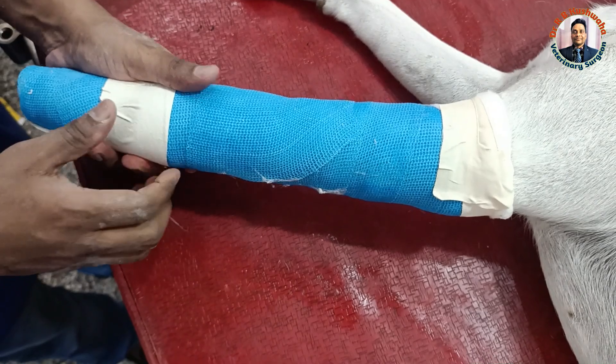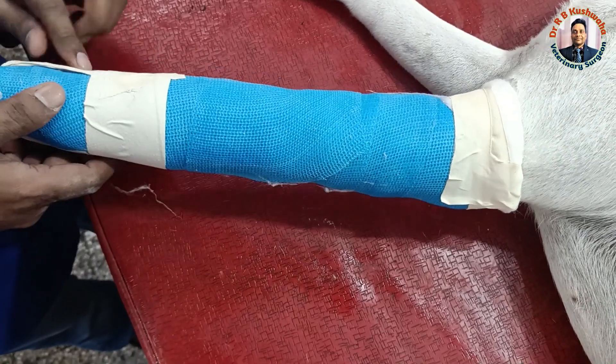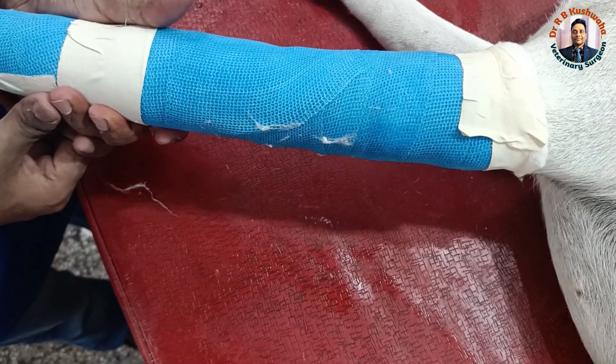This tape is not for pressure over the cast — the cast is already very effective — it is just to secure these two strips.